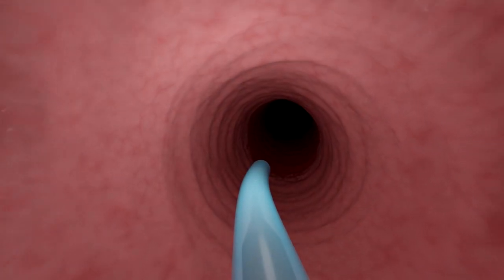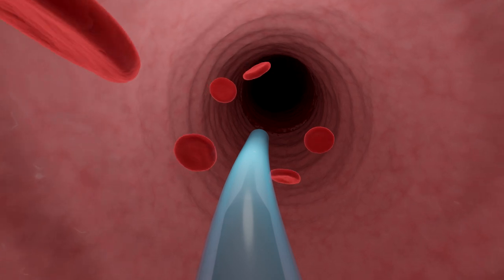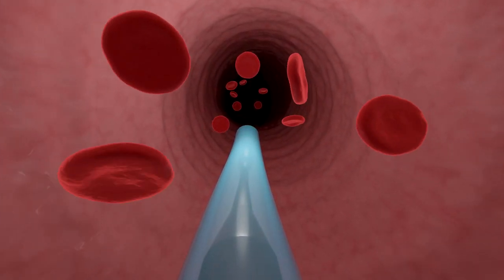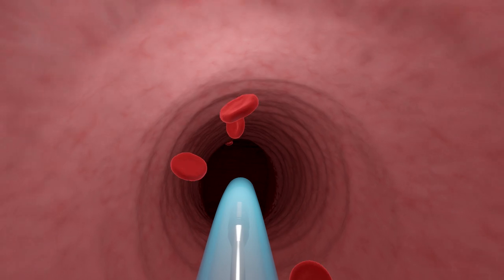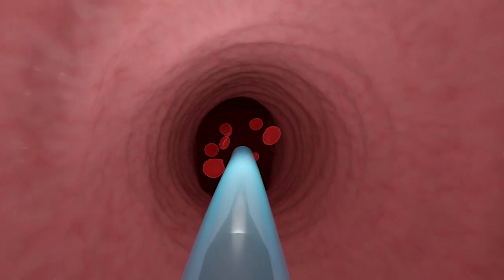This is the insertion vein. With standard guide wires, pick malposition can occur, such as advancing into the internal jugular vein. Unlike standard guide wires, the NaviCurve Stylet features a flexible tip and a curved body design that directs the catheter towards the SVC.